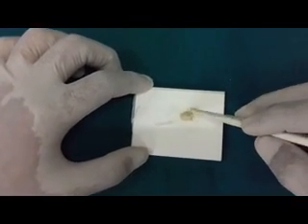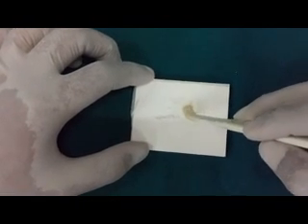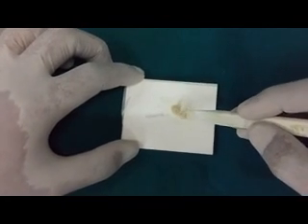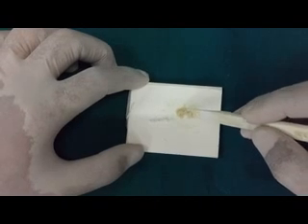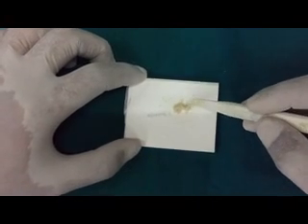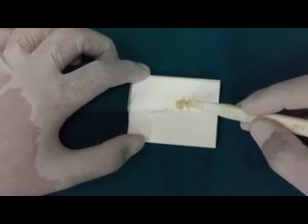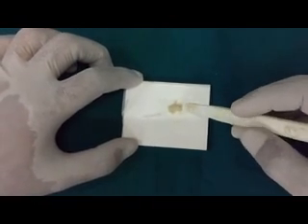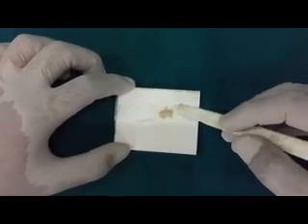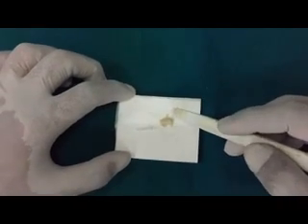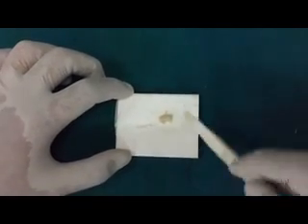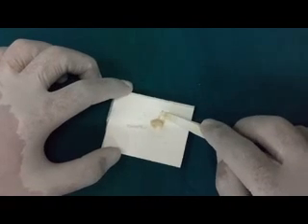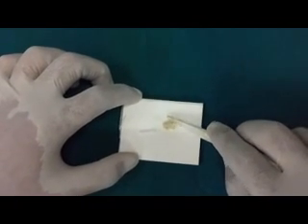The material should be picked up before this stage and packed into the cavity and contoured. The excess material from the restorative cavity is removed using a sharp instrument and then allowed to set under dry conditions. Dry only to maintain the isolation and not to desiccate the surface of the restorative material.